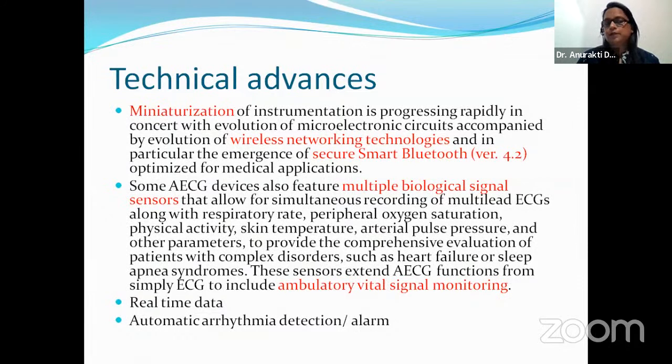The best thing is the miniaturization. The machines have become smaller and smaller, the patient part especially, so it is very acceptable for the patient to use them. The second is it being wireless. Having wires all around your chest is something which is quite unlikely to be used by patients with great enthusiasm. But with wireless, you just put a patch or something.